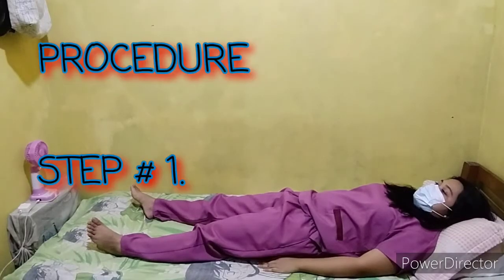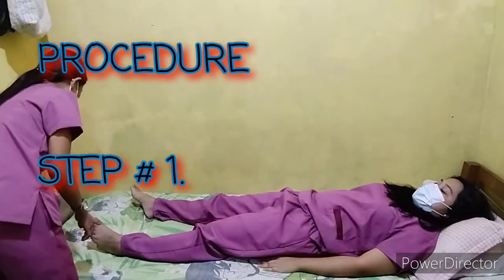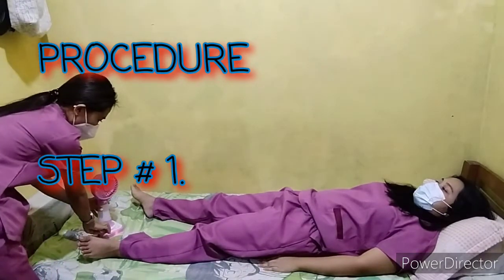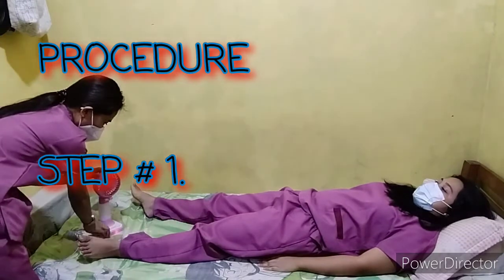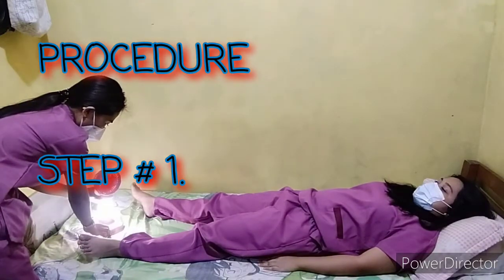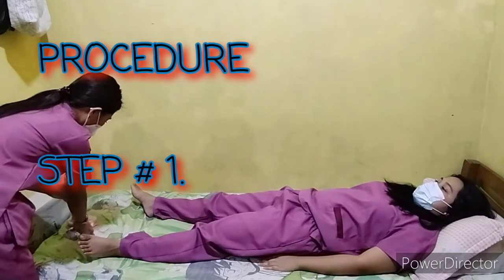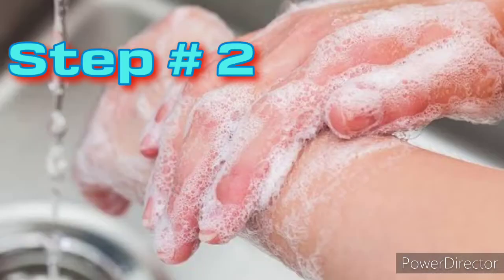Step number 1 in the procedure, ensure that no more than a 60-watt bulb is used for a heat lamp, or that the infrared element is in place for infrared treatment. Additionally, to ensure safety, the right amount of light needed promotes healing and effectiveness of the given heat. Perform hand hygiene to prevent the spread of microorganisms.